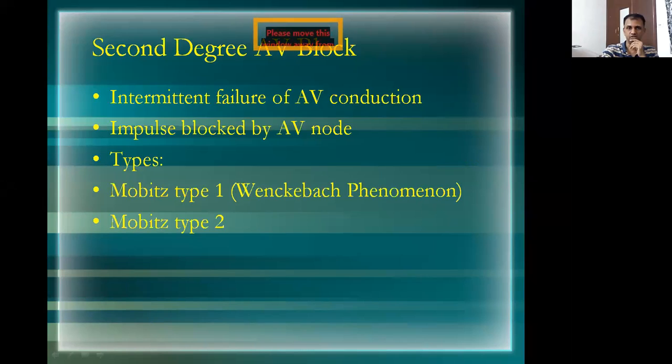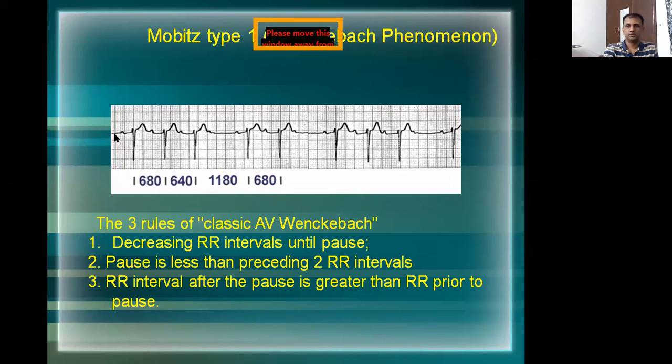Just let me show an ECG. Right here, if you see this ECG, can you see this P wave?